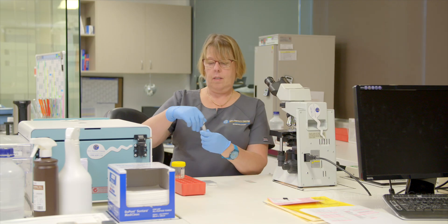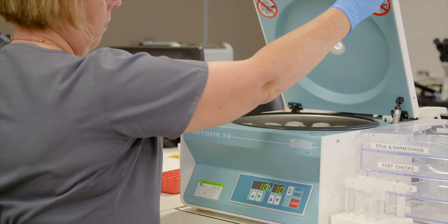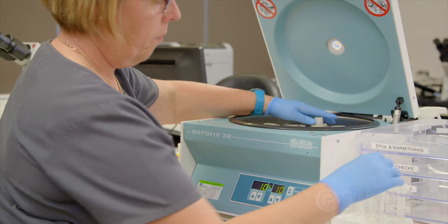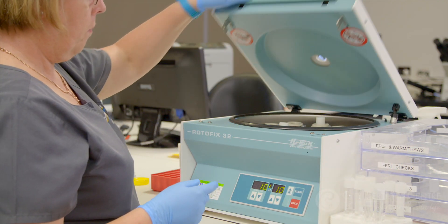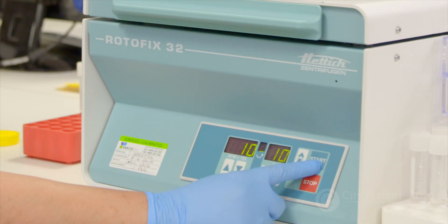The sample is then spun in a centrifuge through a density gradient that does the same thing as a sieve, separating the best sperm from the rest. These are spun and washed again and set aside for insemination.